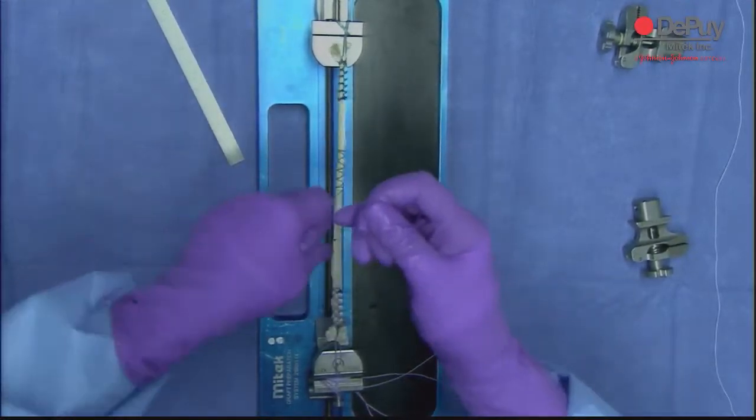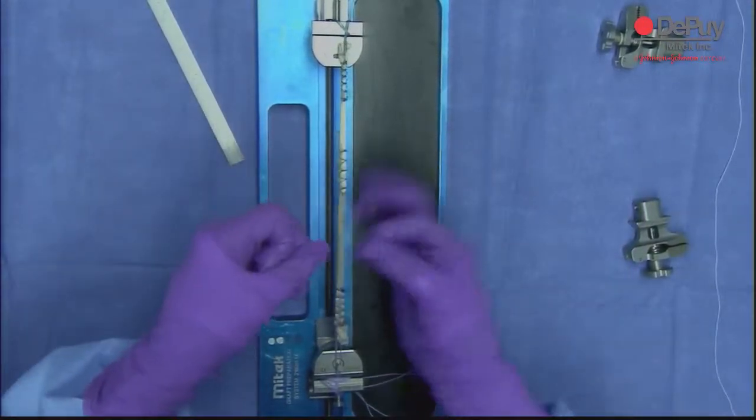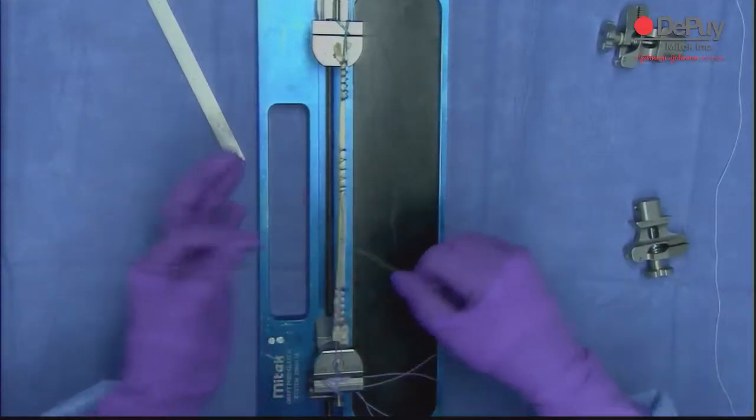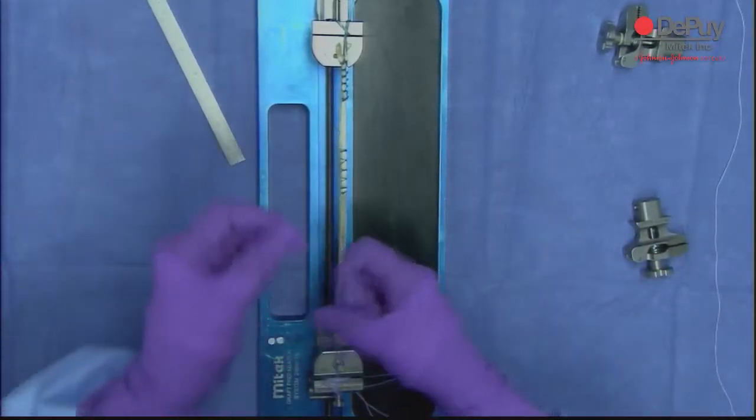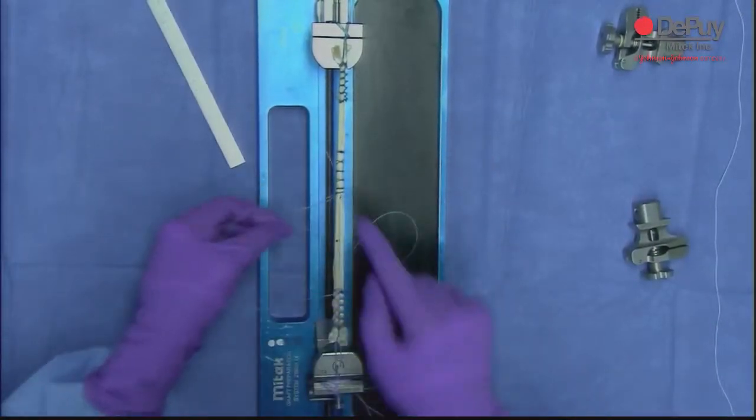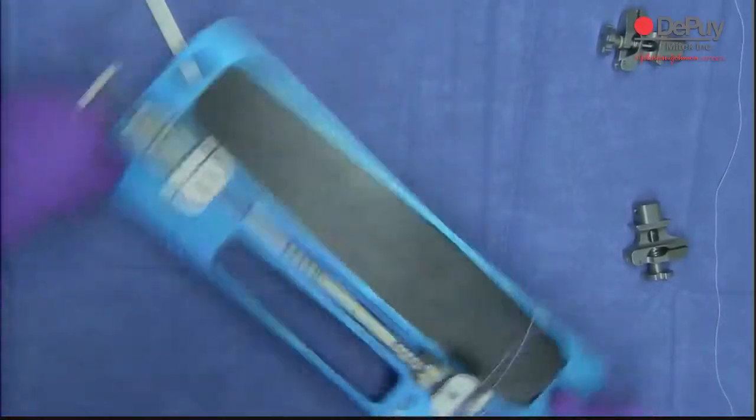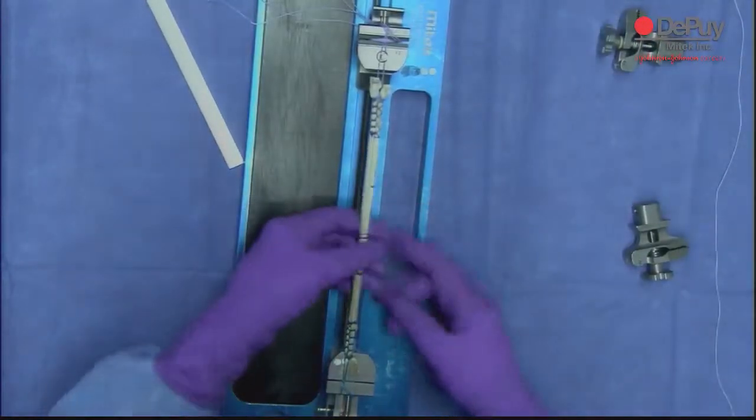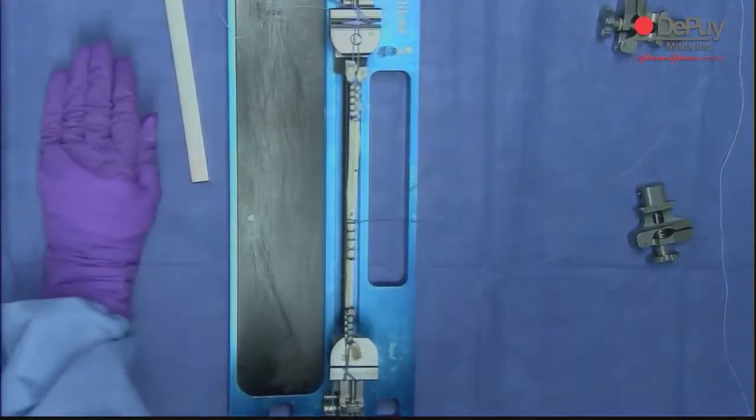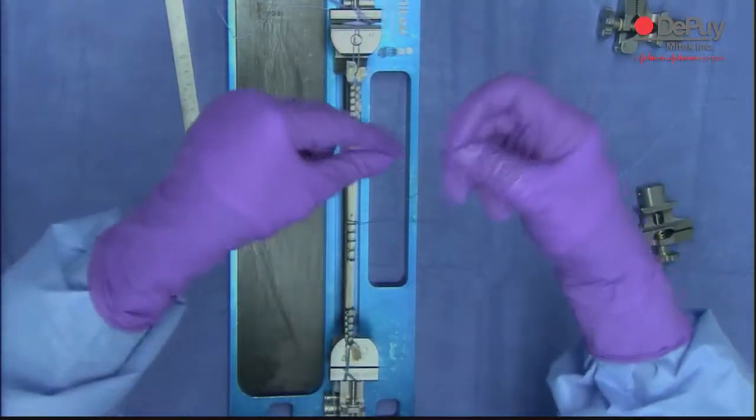And then here, instead of ending it off with the little slip stitch thing, you actually want to tie it off. The reason I start here and go to here is so the knot, once it's cut off, is going to be up inside the tunnel. Now I'm going to make a switch. It's much easier to sew towards you than away from you. So I'm just moving the graft board and starting here.